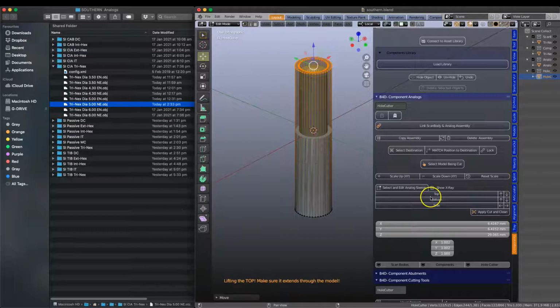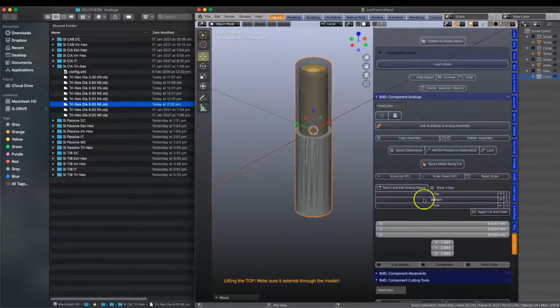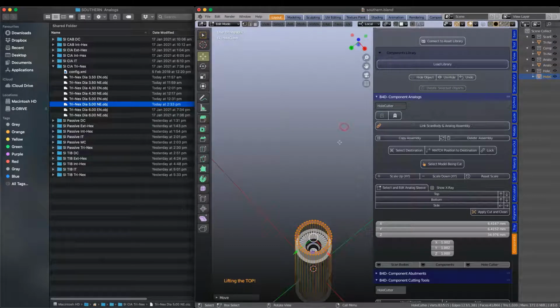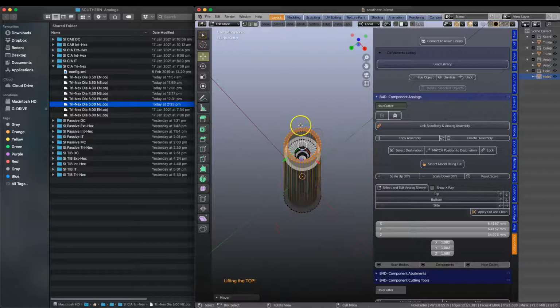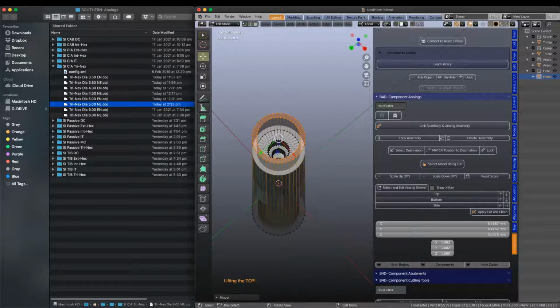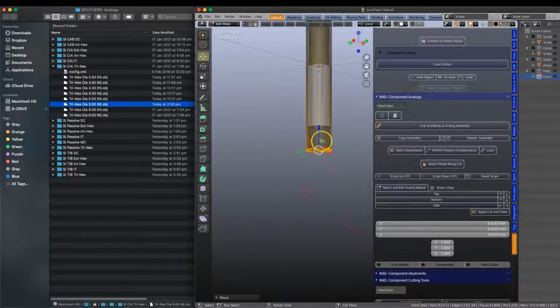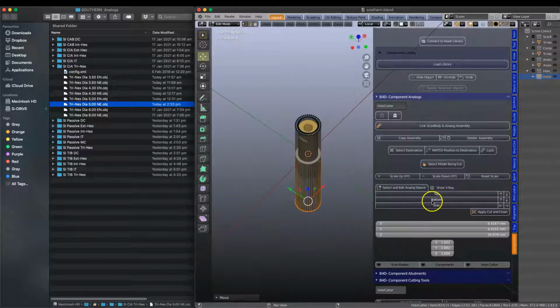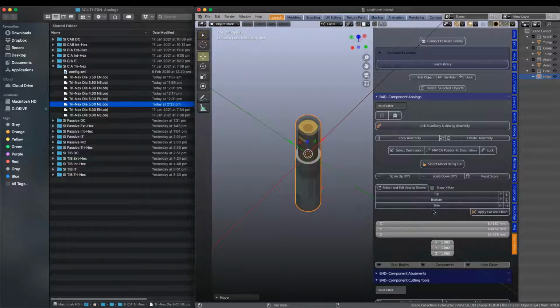Okay. And then we can click on that, takes us back out of edit mode. Click on bottom and then pull it out. So you should see the surface like that, and you should see the top surface like this. Okay, so we don't have side, we don't need to use that.